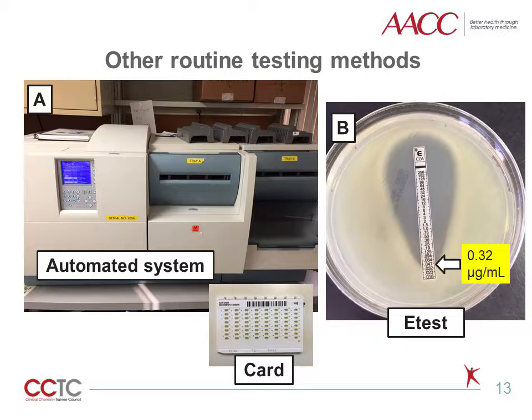Automated antimicrobial susceptibility test systems are commonly used in microbiology laboratories due to their ease, short turnaround time, and high volume capacity. Usually, a suspension of the isolate is inoculated into a card or cartridge containing antimicrobial agents in a couple of concentrations, placed inside the automated platform, and incubated. Automated systems can provide results within hours by measuring subtle changes in the growth by turbidity, fluorescence, or colorimetric reactions.